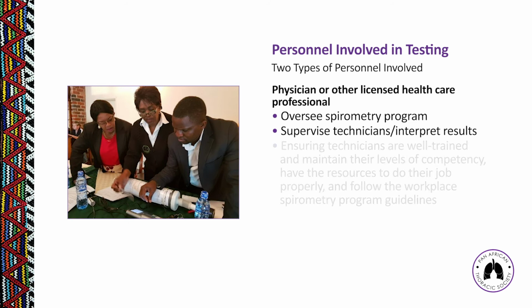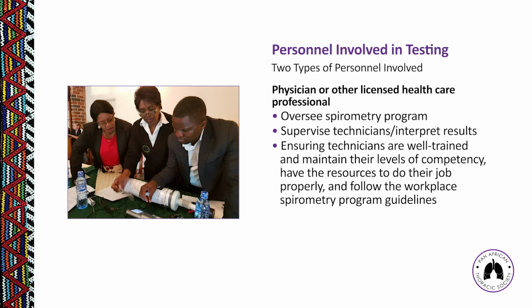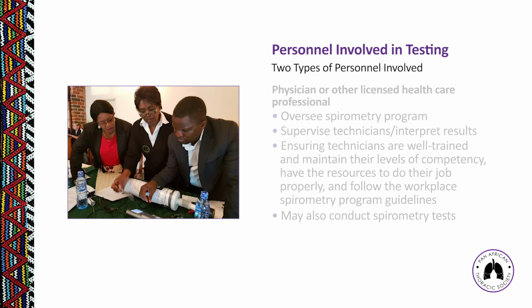And they would ensure that the technicians have all the equipment they need to do their job, that the technicians are trained, that they're maintaining their levels of competency, and that they have all the resources they need to do the job. In some cases, this person might also be the one who's conducting the test. It just depends on the workplace itself, how big it is, how many people they have available for spirometry testing.